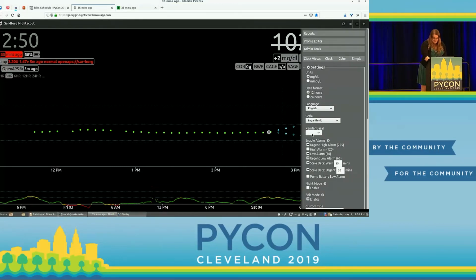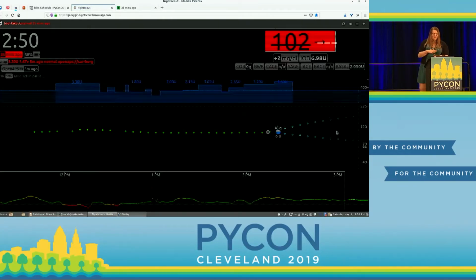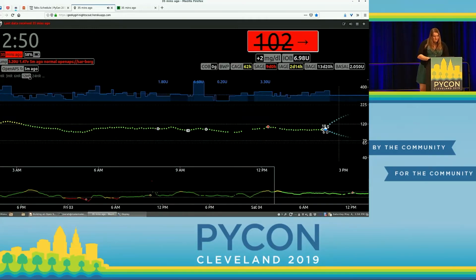But I can also turn on basals. And the basals is that all-day value, we can see up here in this blue bar. So there's a dotted line. It's going to be really hard to see on the screen. That's the default value that's programmed in the pump. And those blue lines are it adjusting my insulin throughout the course of the day. So there's a couple times where it's just like, I'm going to give you a lot more to try and keep that level. But other times where it's just like, hey, you're doing fine, let's dial that down a bit. So you can see over the course of 12 hours, it's made a pretty good amount of adjustments.